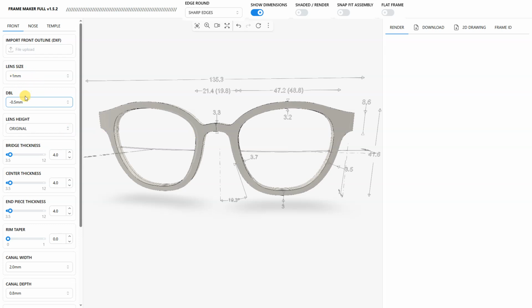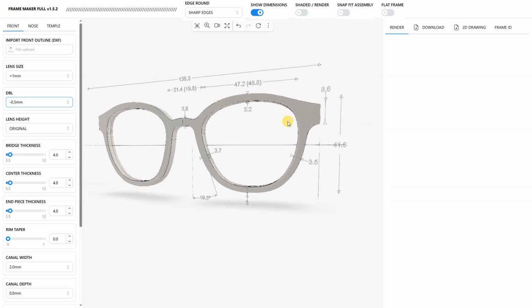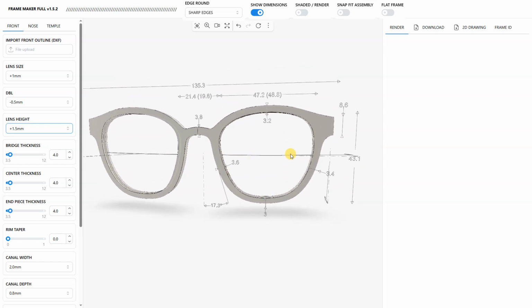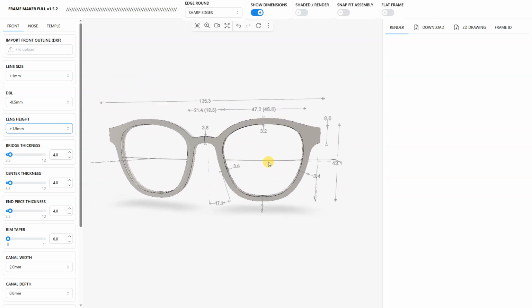So that has to do with sizing, lens height, same thing. I'm not going to do it now, just going to move forward, but it's the same thing. And everything is changing without changing the key measurements. Like for example, if we change the lens height, let's say we add 1.5 to the height. I'm going to do it. I said I wasn't, but I am. Just to make sure we don't want to change the end piece height because that has to match your temple height. So it's going to change everything regarding the lens size, and in this case shape, or the DBL, but it's not going to change your overall geometry.